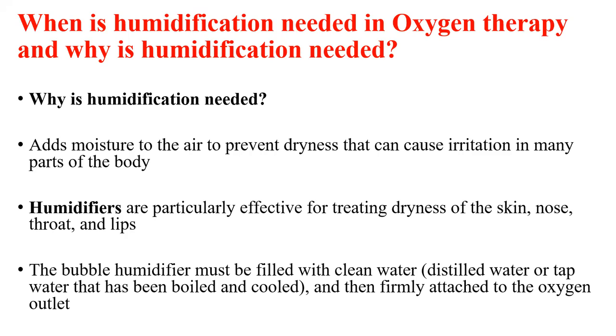Humidifiers are particularly effective in treating dryness of the skin, nose, throat, and lips. We use distilled water or clean water to humidify our oxygen, meaning that there is an outlet attached to the oxygen that contains water that will humidify it. Next slide.